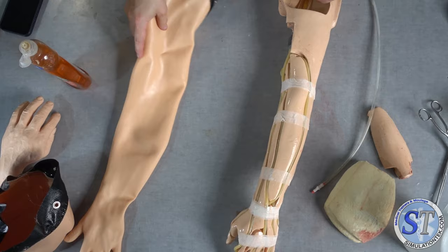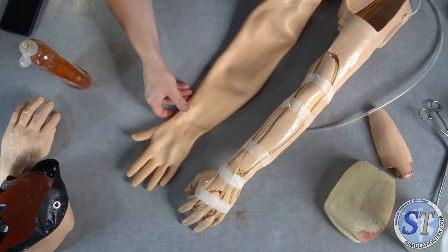Got one of my littlest helpers off camera handing me things. Get the prized Leatherman out of the way. Get my tubing and all that stuff. And we're just gonna kinda lay this next to each other, and match it up, make sure you've got it oriented right, things like that. We're just gonna slip it in.